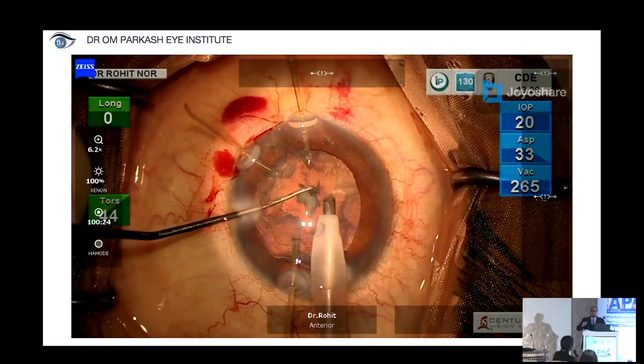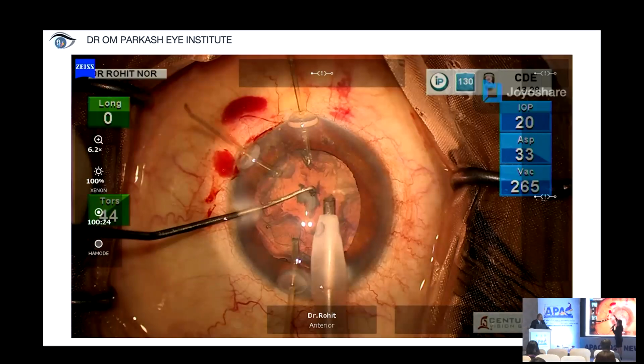The tricks which each one of us here uses to decrease the zonular stress which is there with the normal CTR, which is not there with the spiral CTR. In the first part, I don't inject all the way. I will just withdraw my injector. If I start injecting here, which is my favorite place, then as I push the CTR out, I will move my injector this side.